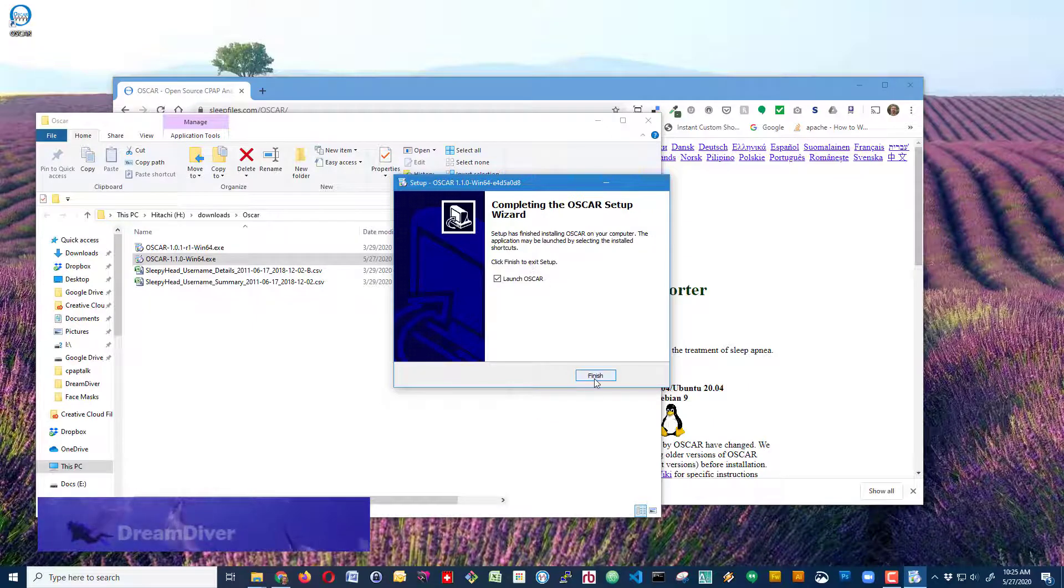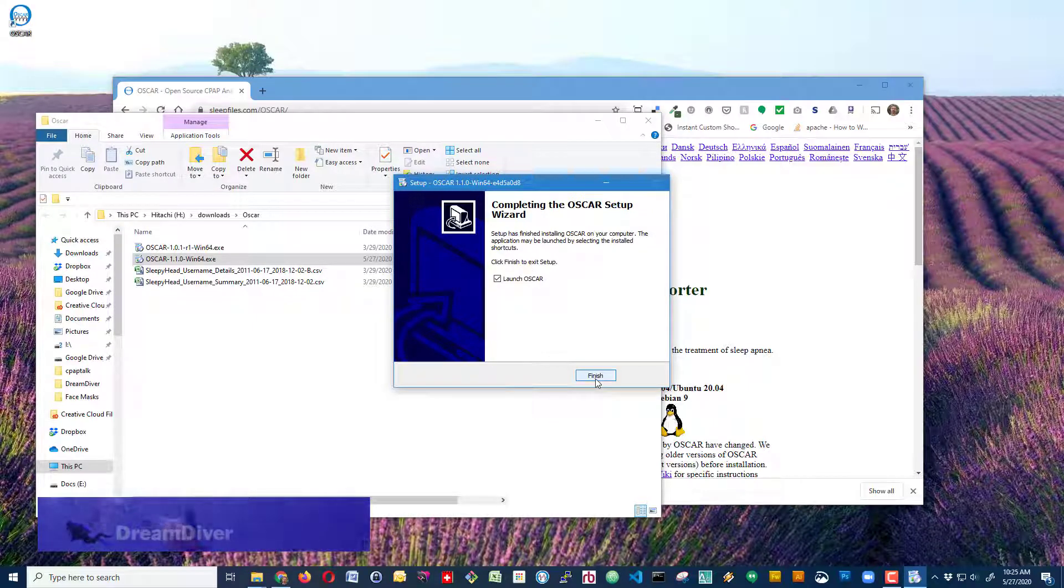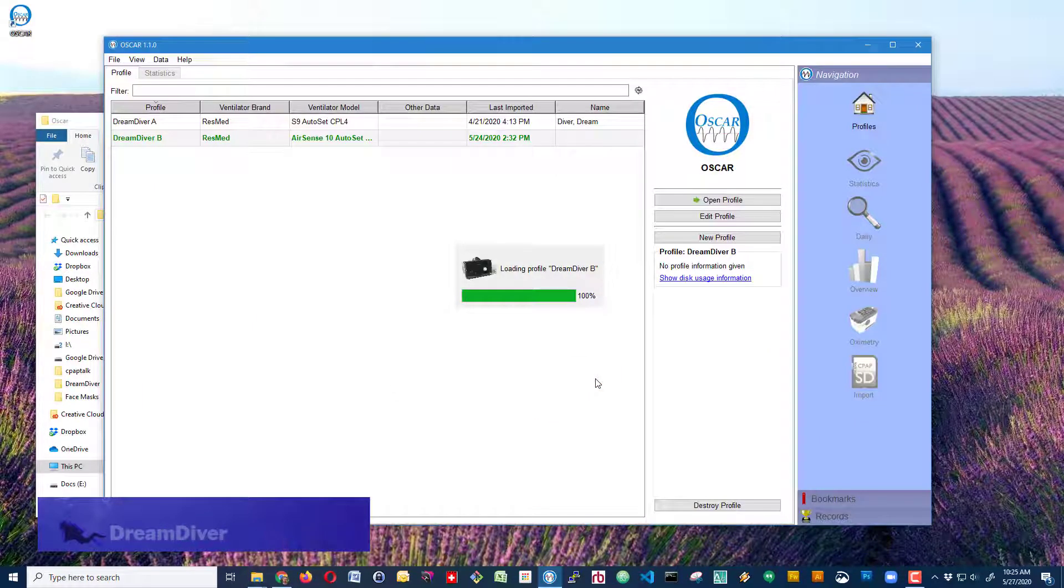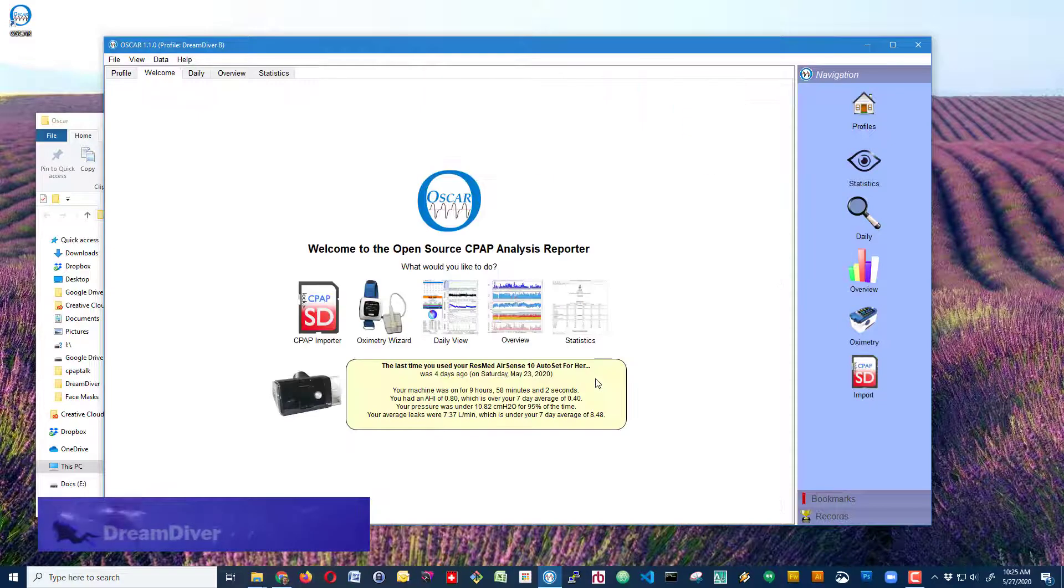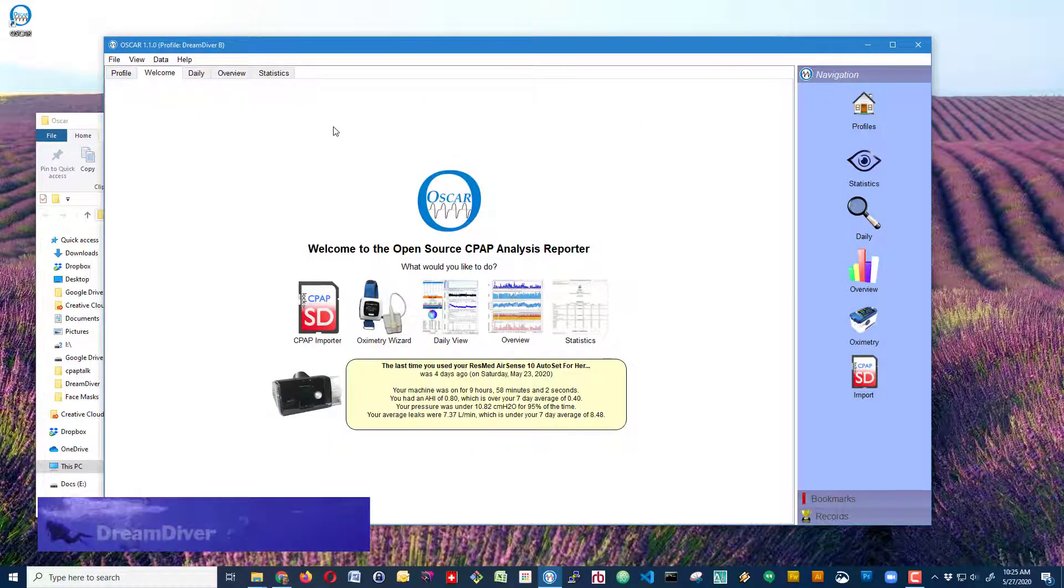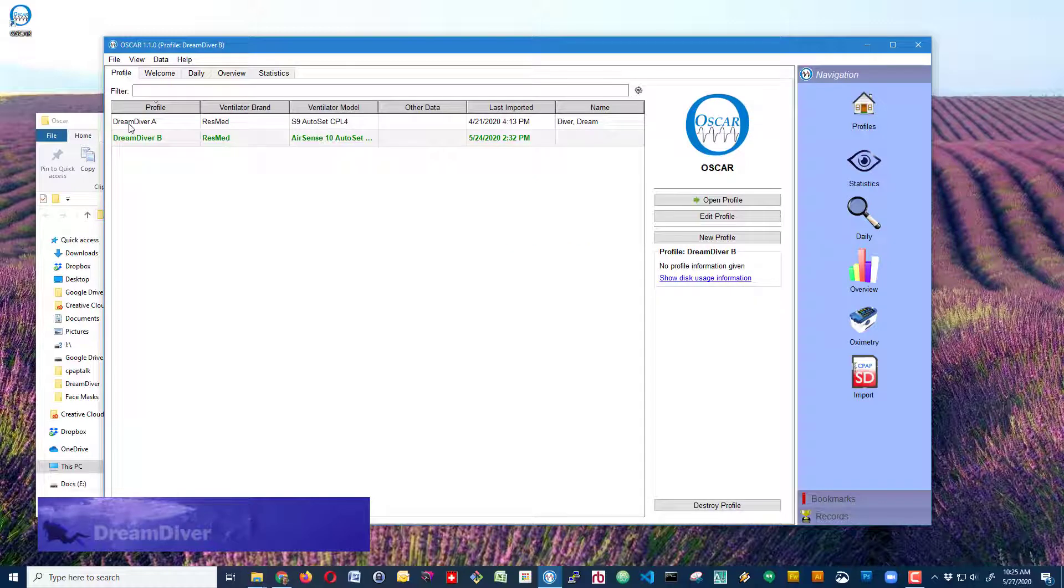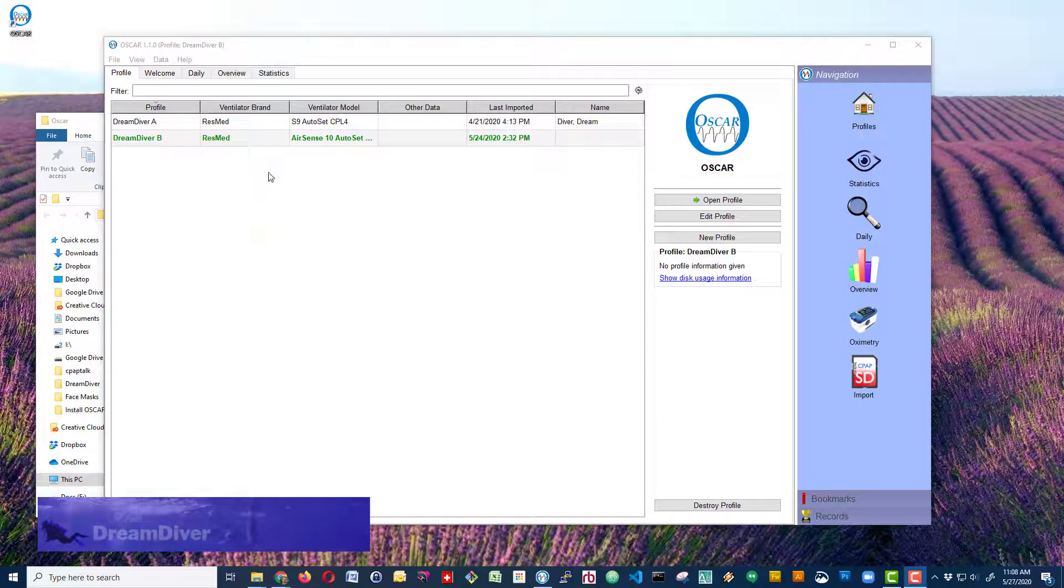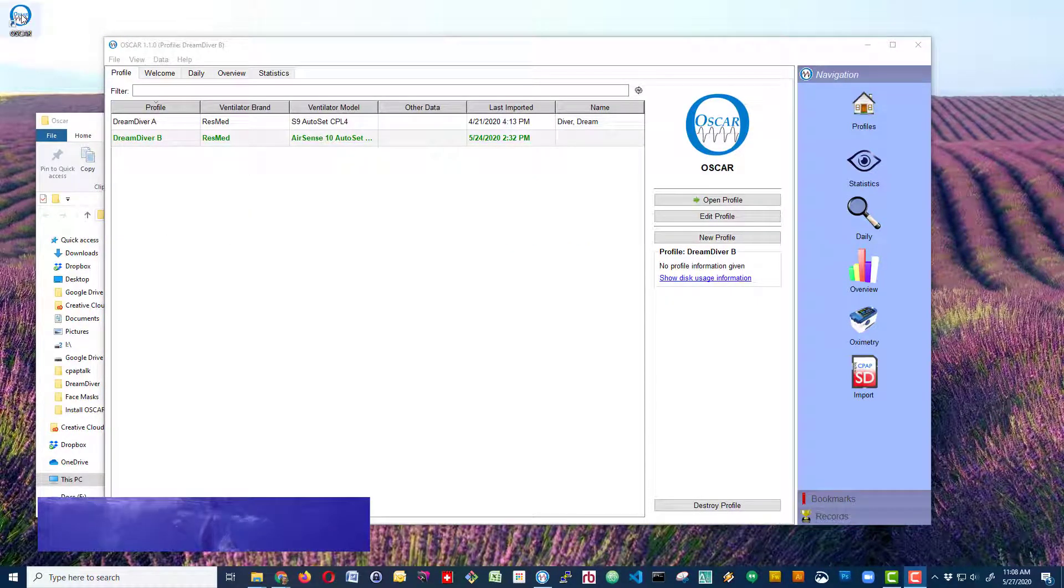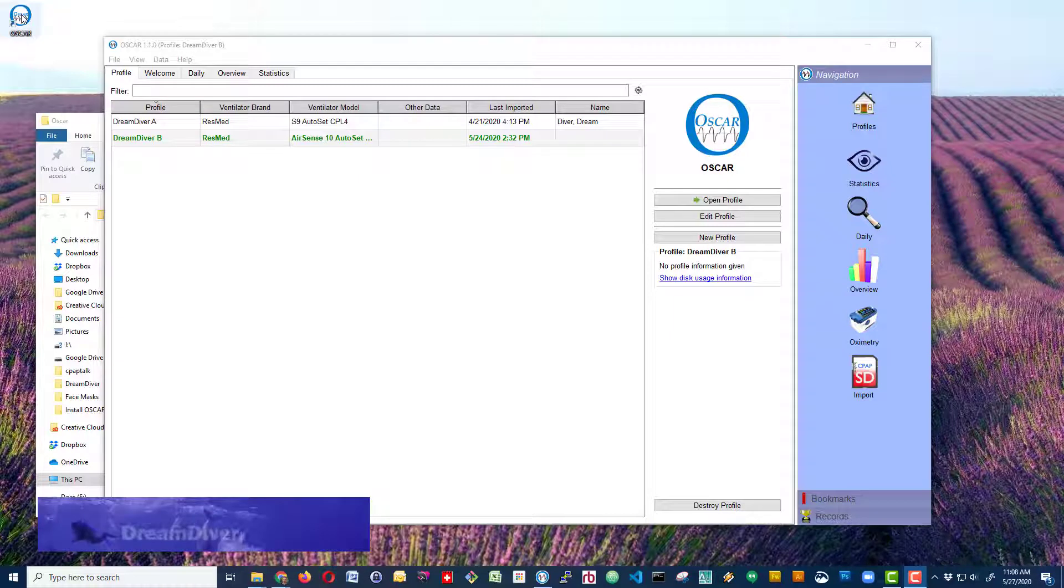Next, I'm going to launch OSCAR. Now since I've already installed OSCAR before, I've already got some profiles in here. Also notice that we have the OSCAR icon up in the corner here where it was installed.